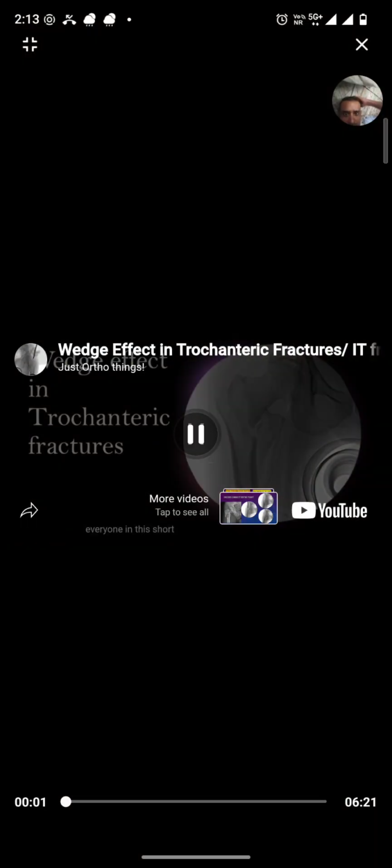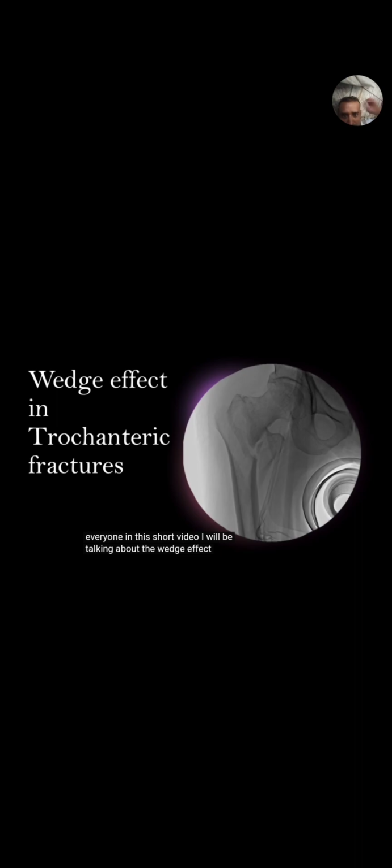Everyone, in this short video I will be talking about the wedge effect in trochanteric fractures, how it interferes in your reduction when you are going to perform intramedullary nailing for trochanteric fractures. So here comes the example.